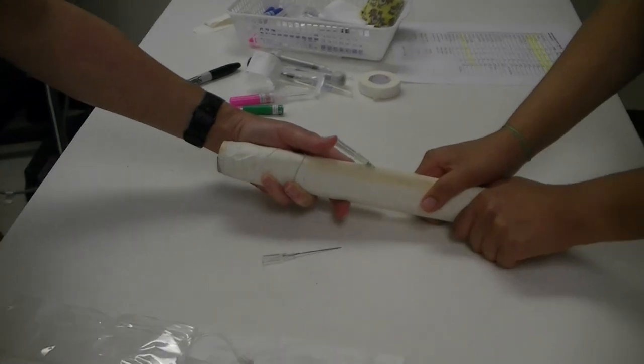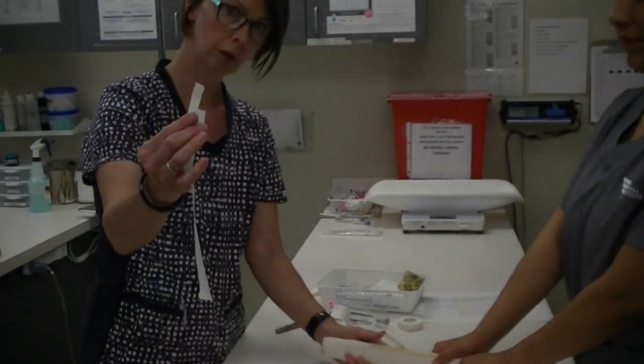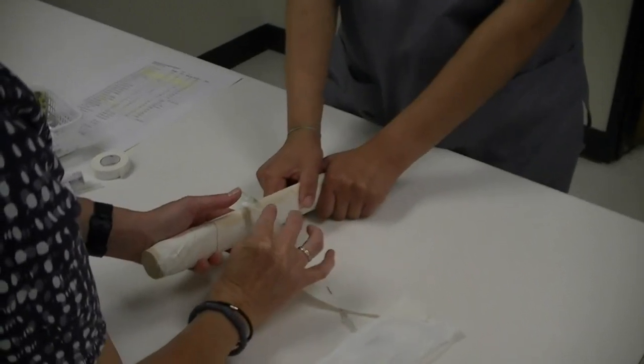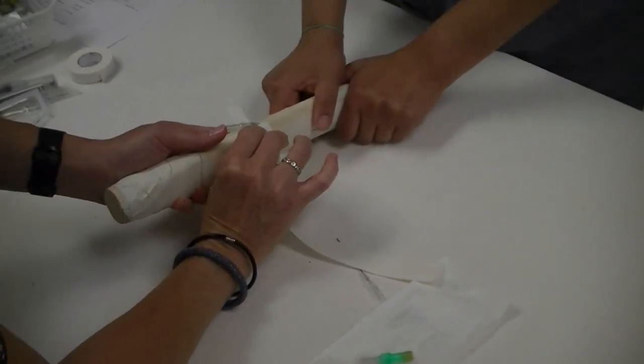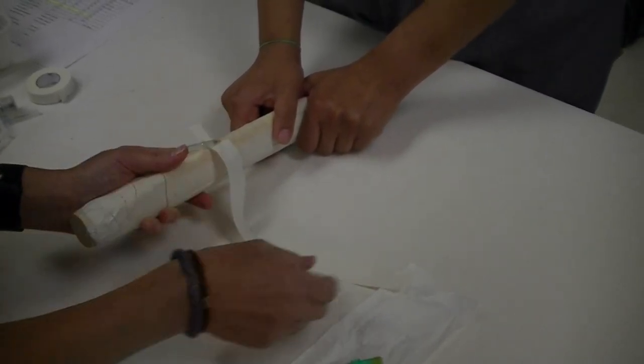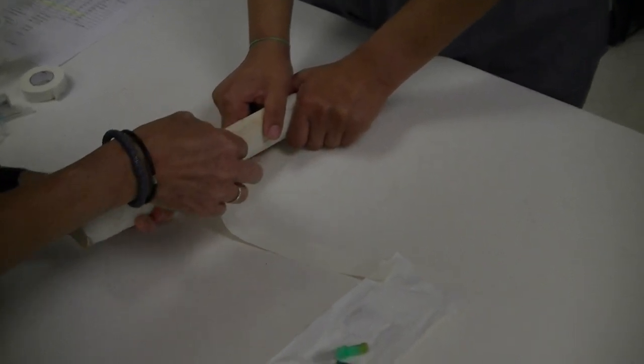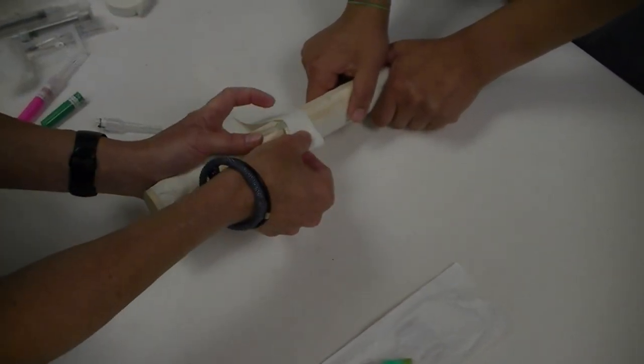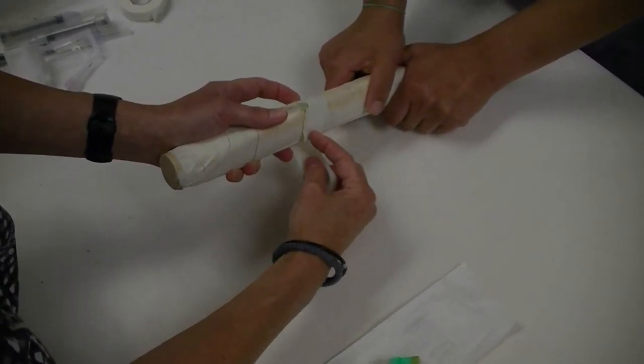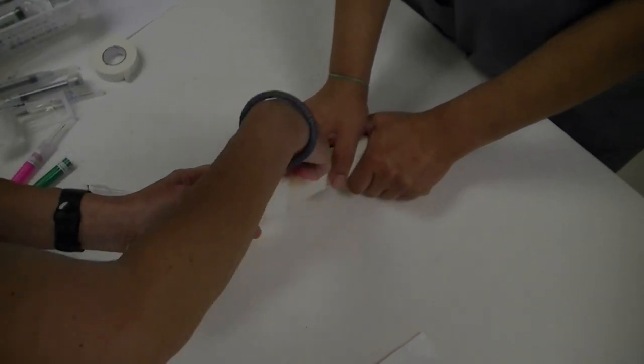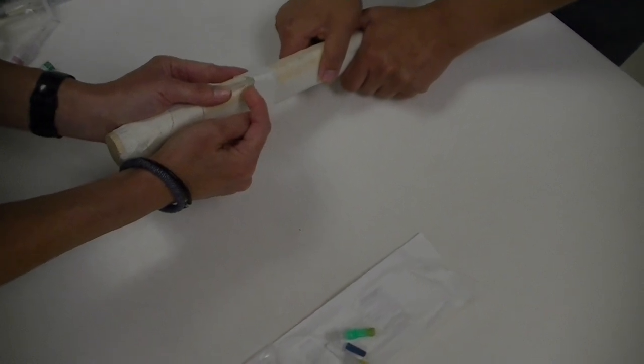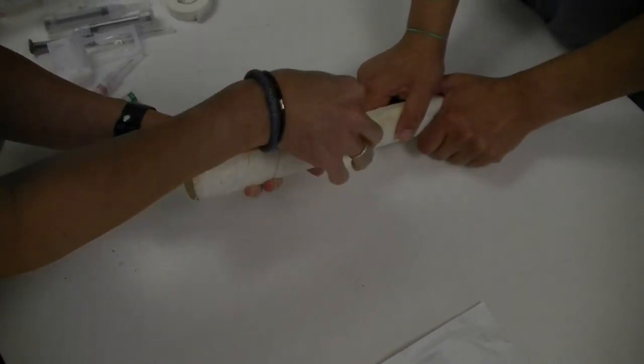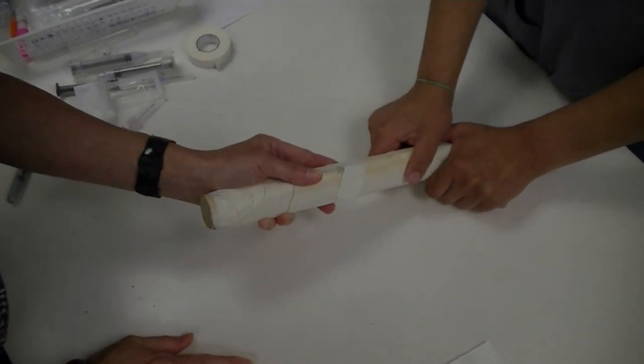My first piece of tape is that piece that we split down the middle, sticky side up. I'm lifting up on the catheter body with my thumb, placing it sticky side up, and then I'm going around the catheter hub, sticking to itself. Now I'll come around the top of the catheter and around the limb, keeping the attachment point of the catheter free of tape—otherwise I won't be able to attach my injection ports later. I want to make sure that tape is stuck to the catheter and to the patient.